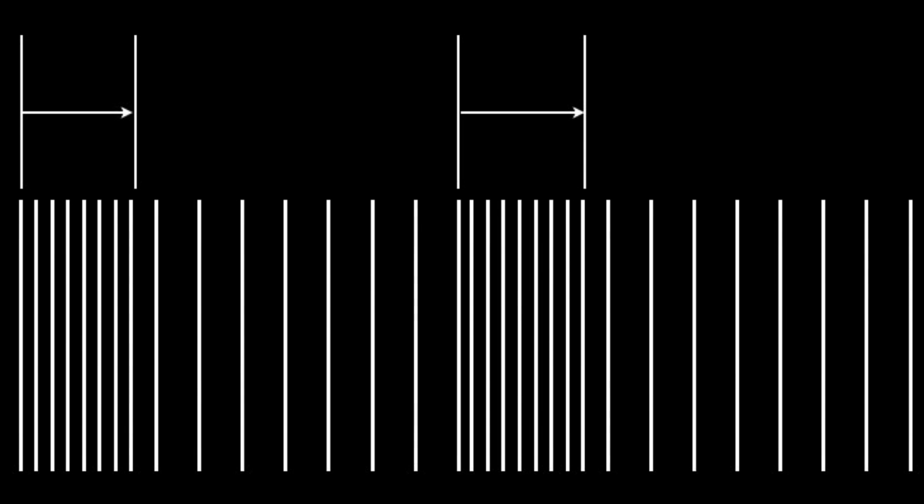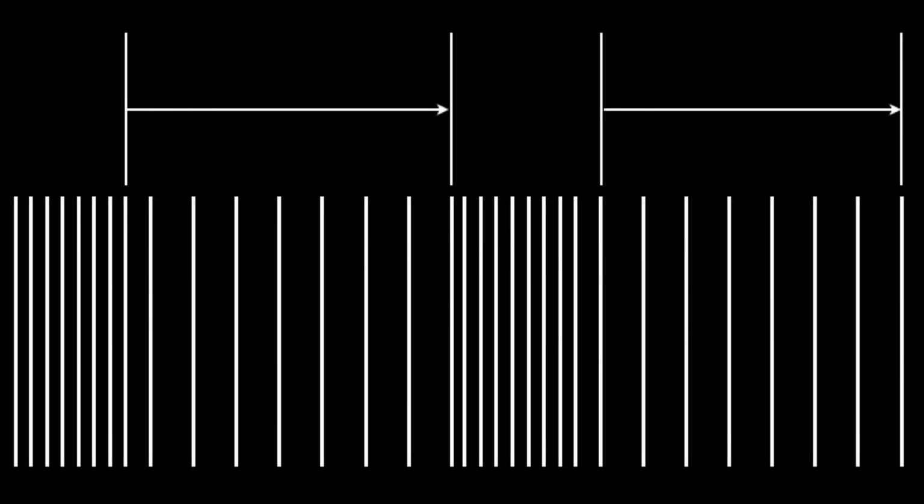Now, ultrasound is a pressure wave. And what happens is it causes tissue to vibrate, and that tissue vibrates and causes areas of compression where the molecules and the elements of that tissue are closer together, and areas of rarefaction where they are more spread out. And this is how that pressure wave propagates through tissue.